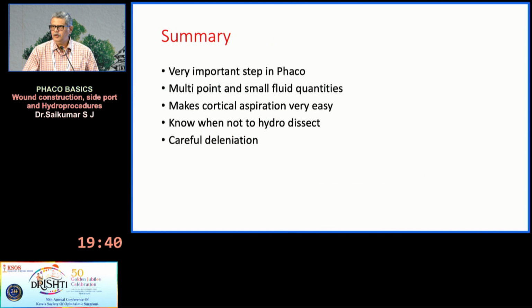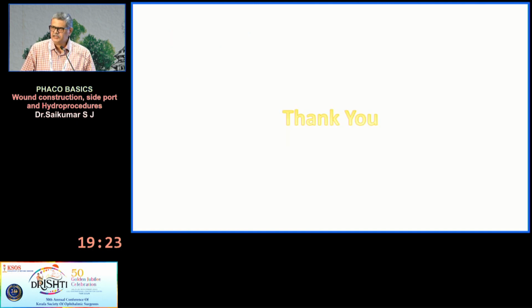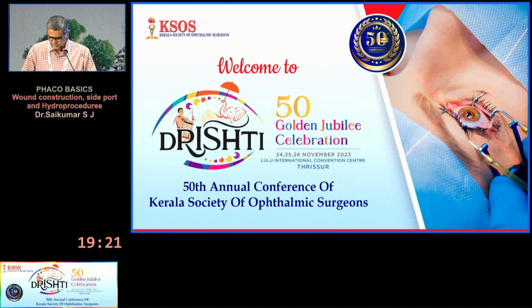So in summary, hydro procedures and wounds are very important. Multi-point, small fluid quantities to be used. It makes cortical aspiration very easy. If you've done a good hydrodissection, your cortex aspiration is very easy. You should know when not to hydrodissect at all, and you should also do a very careful hydrodelineation in select cases. Thank you very much for your kind attention.